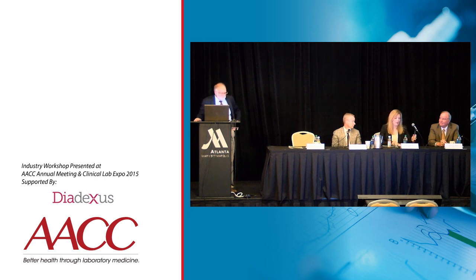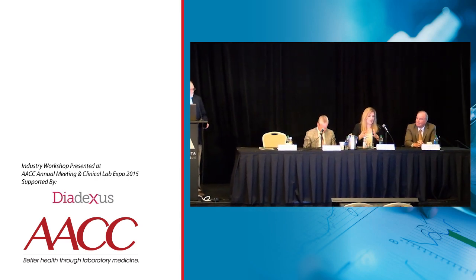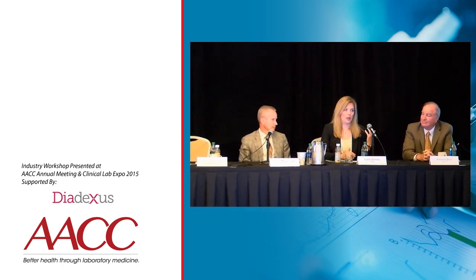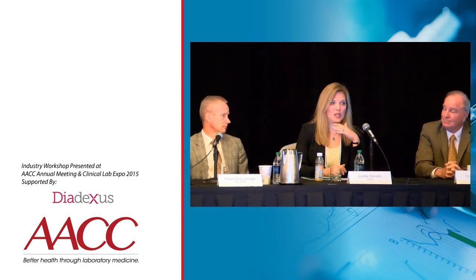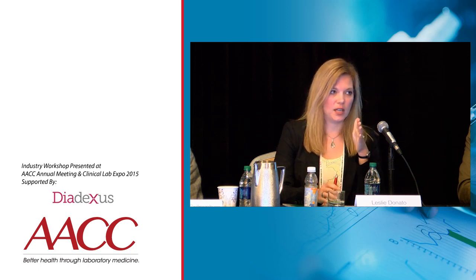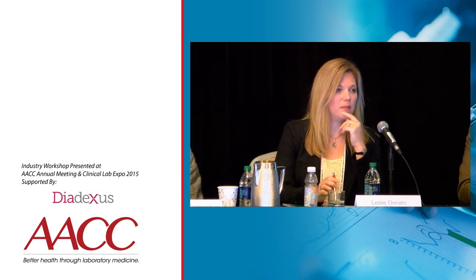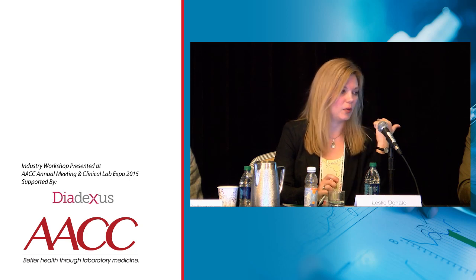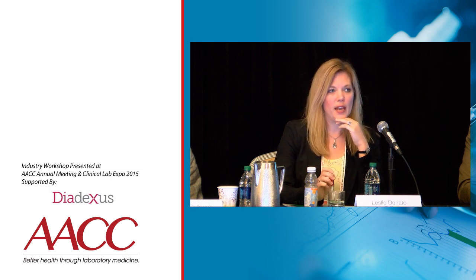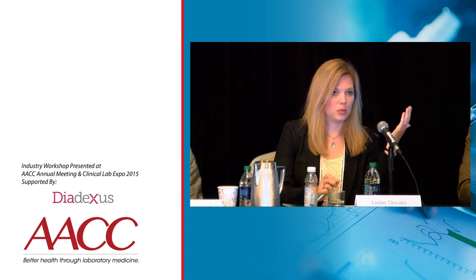Yeah, and I think Ken presented this data as well, that it's really quite stable. For the activity assay, we found similar data to what Ken presented. There was some lot-to-lot variability in the concentration assay that we found in previous studies. That's really not the case in the activity assay. The stability of the analyte is really rock solid from day-to-day. We showed the same CVs, very, very stable. And that's really important. And with freeze thaws, you can do multiple freeze thaws and get the same activity.